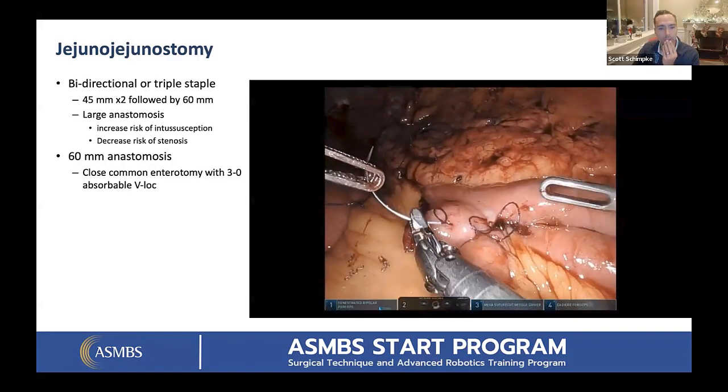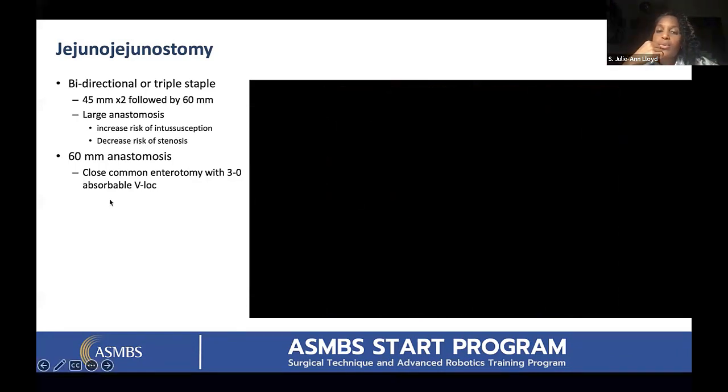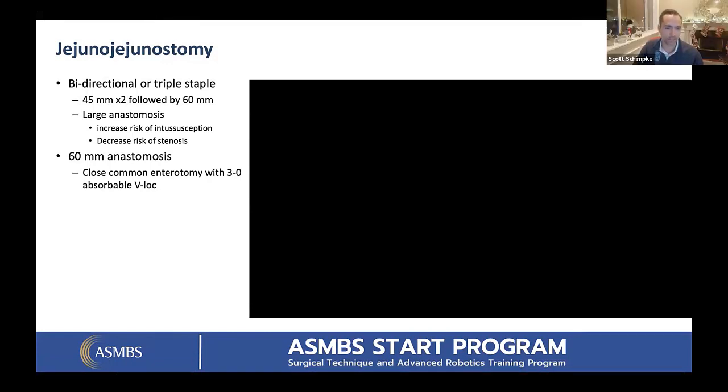Yep, so are you guys taking down the mesentery when you separate the omentum? No. I don't know. We've had a hot debate here at our... You don't divide the omentum, Scott, right? I almost never do. If it's really thick and I need it just to make sure I have adequate length or it's getting in the way, I will. But if it's not in the way, I don't mess with the omentum. Every time I look at the omentum the wrong way, it bleeds. So I just stay away from it if I can. How about you, Dimitri?